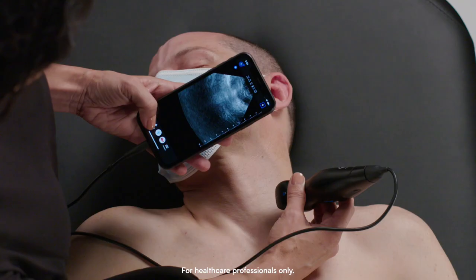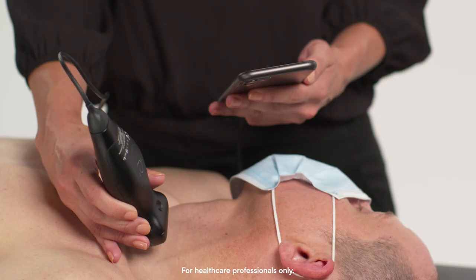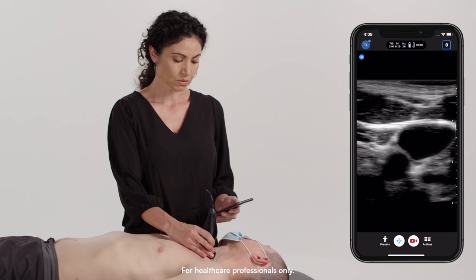To begin, I'll select my carotid preset and I'm going to place the probe just above the clavicle. You'll see the internal jugular vein collapsing and you'll see the common carotid artery medial to it.